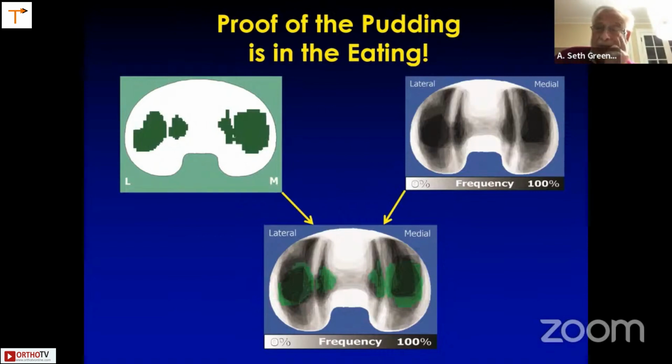The progressive darkened areas suggest a commonality of damage locations amongst the retrievals. The lower image is an overlay plot that visualizes the prediction of the knee sim model and closely matches the abrasive wear scar damage observed in the clinical retrievals.